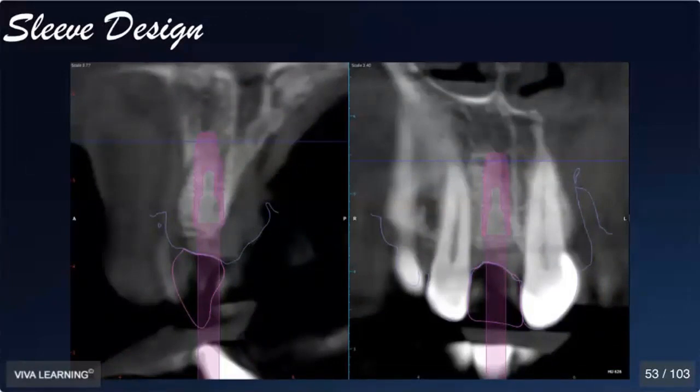Once we have everything merged together, then we have what we need to position our implant virtually in space. So, thinking about all those things we talked about when we were looking at the digital wax-up, merged with our intraoral scan and CT scan, trying to figure out where that ideal implant position would be.